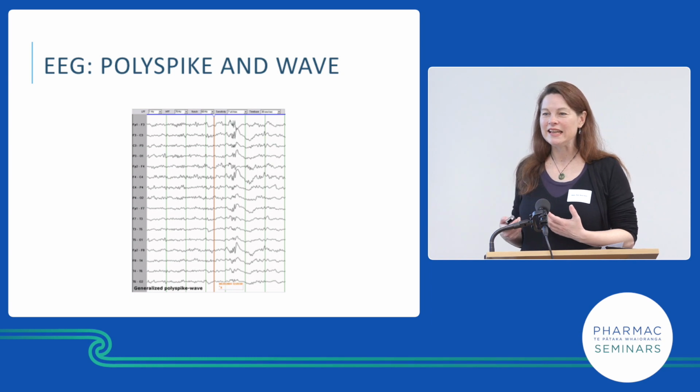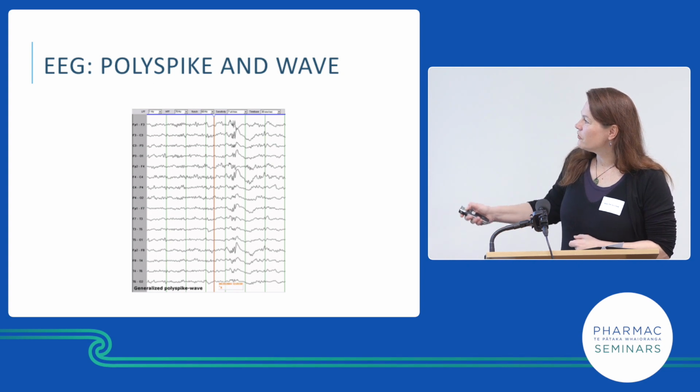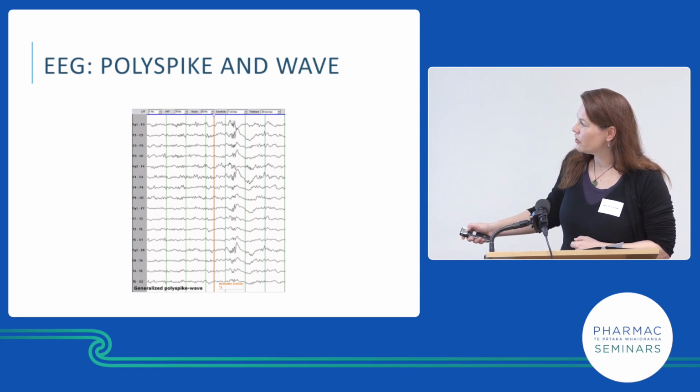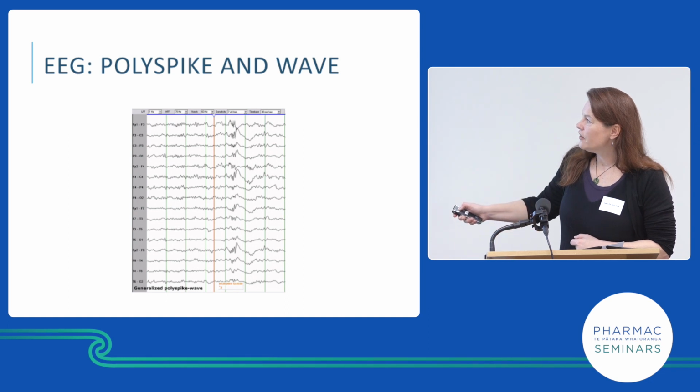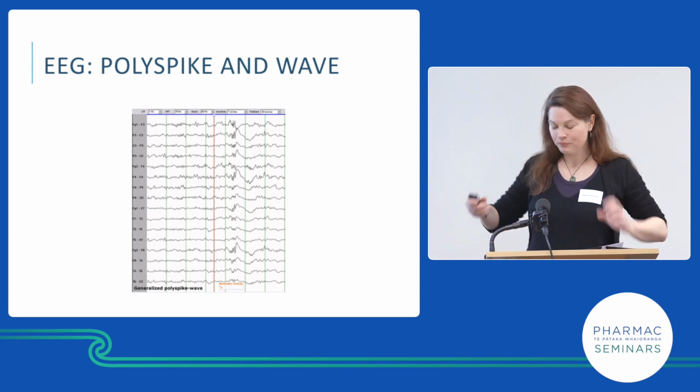It looks a lot like an EKG, just a lot more channels and a bit messier. So this is what it's kind of supposed to look like. And we have channels on the left side up here, and then some on the right, and then some more on the left, and some more on the right, in the front, in the back, front, back. So we kind of look at different parts.